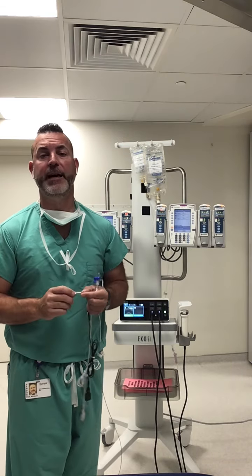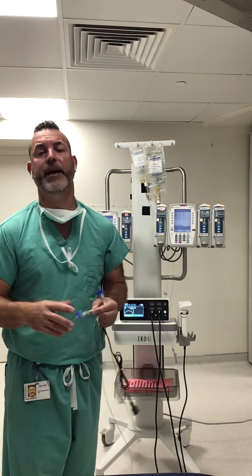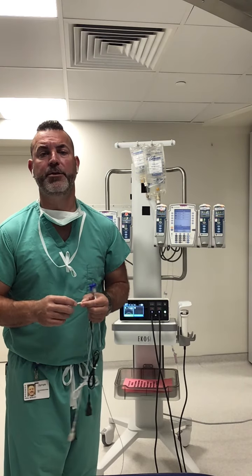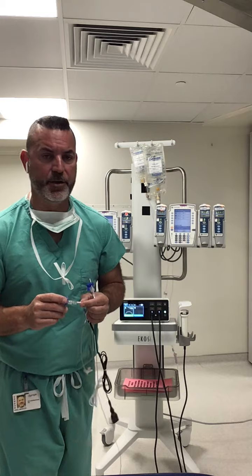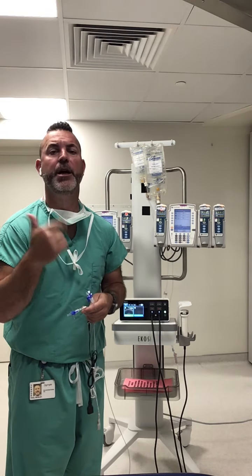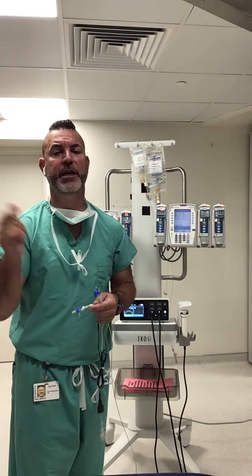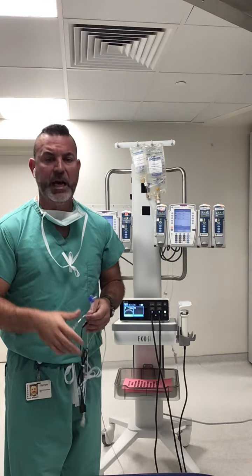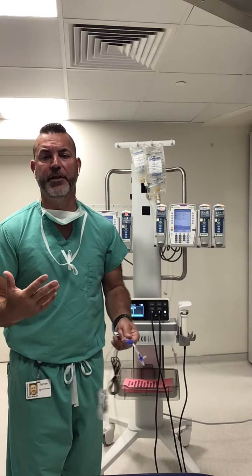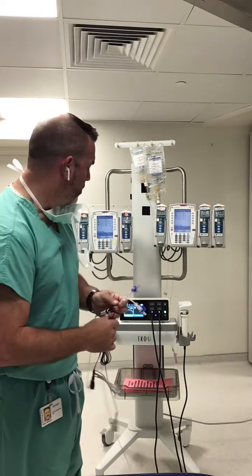We're checking to see if the vasculature has been opened up, and then we're going to be able to explore options of why that vasculature was clotted to begin with, and what other Boston products we can use to open that vasculature back up. So again, PEs, 6 to 12 hours, 1 milligram per hour. Arterial and DVT, we're going to be treating at 1 milligram per hour on average, overnight until the morning. Heparin, again, is non-weight-based, a fixed dose between 300 to 500 units per hour, and again, it's physician prescribed.